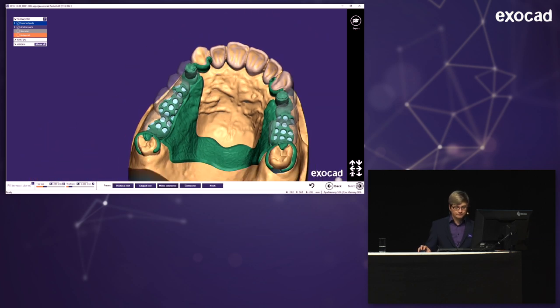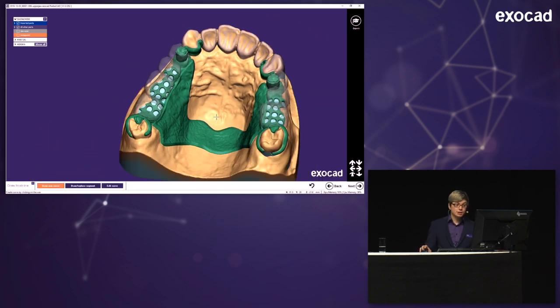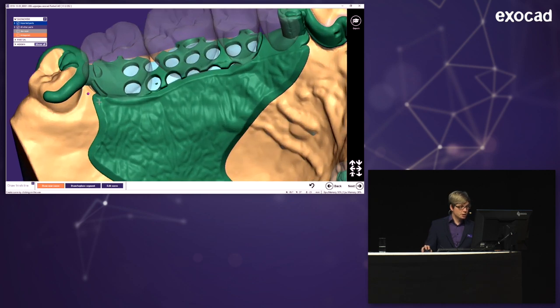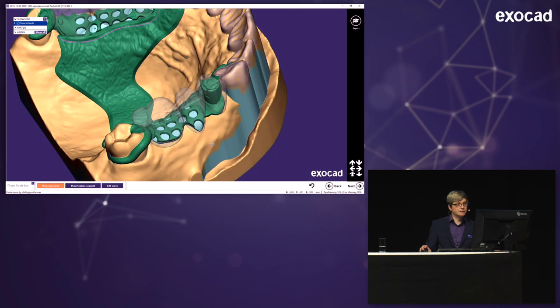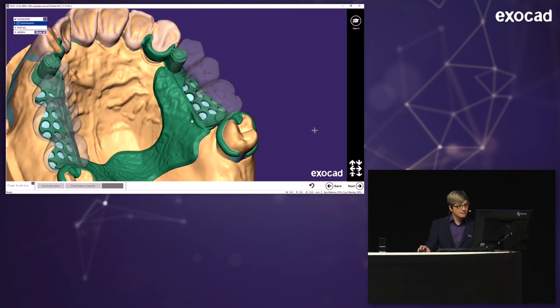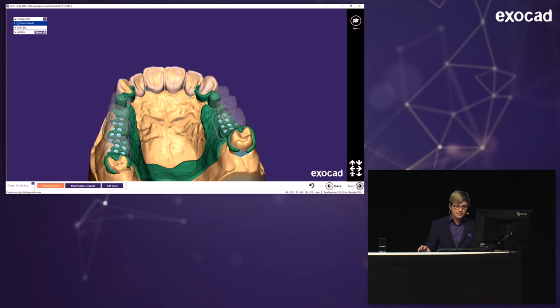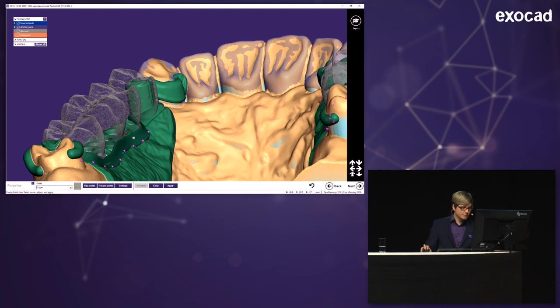That's all I need. So now I'm drawing the finish lines for our acrylic teeth here. And for that, I just start clicking away, just drawing a finish line however I please. And here I will end it about here at the metal dummy, doing the same on the other side. And now on the next step, you can actually place those finish lines.